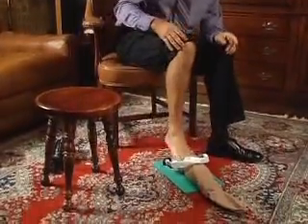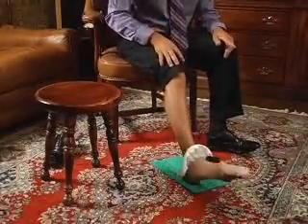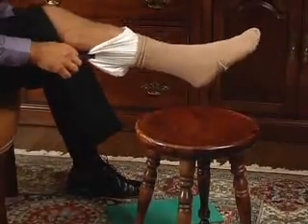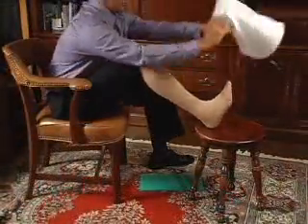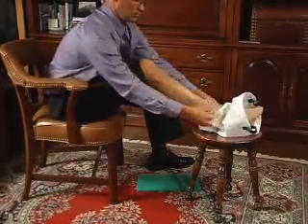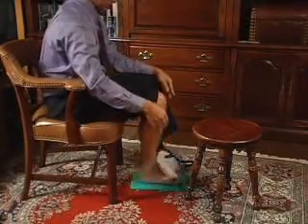In cases where the patient is unable to bend easily, the use of a chair or bench facilitates application of the compression stocking. In patients where bending may be a problem, the use of a chair or bench is extremely valuable for removing the compression stockings.